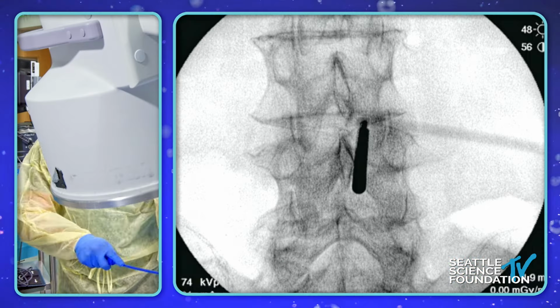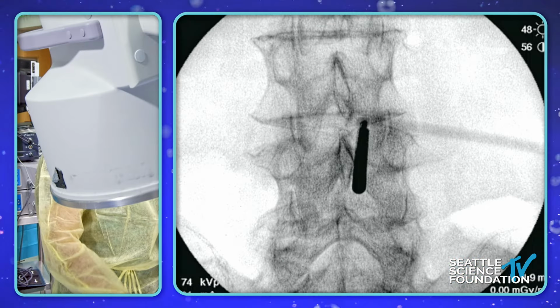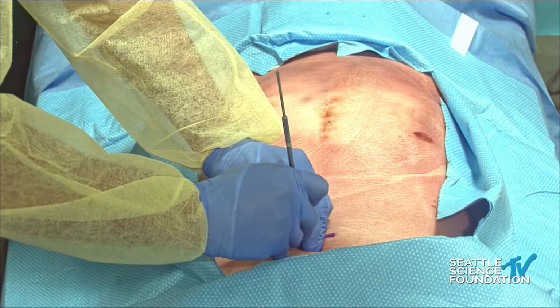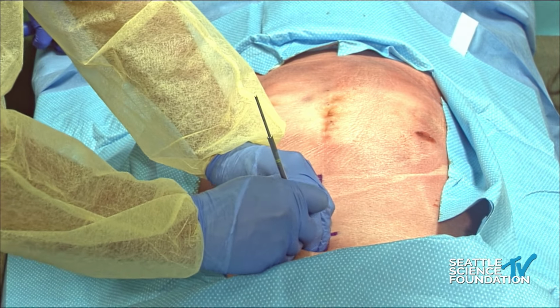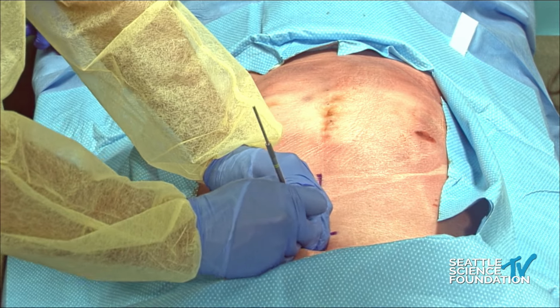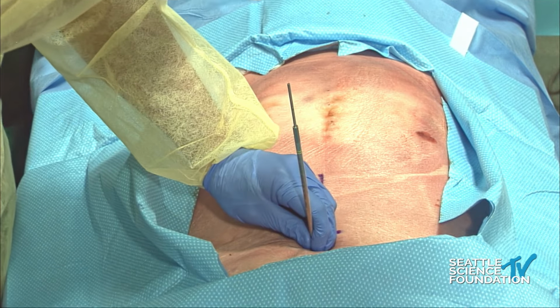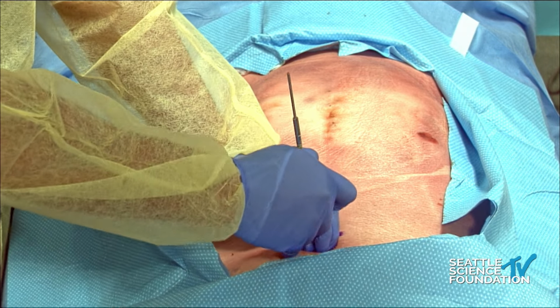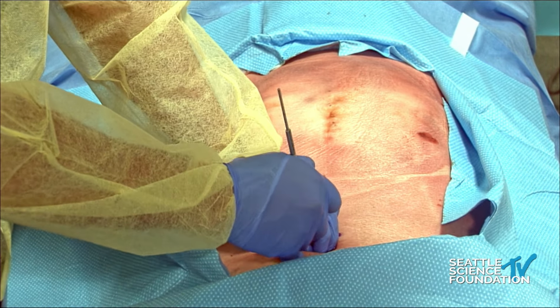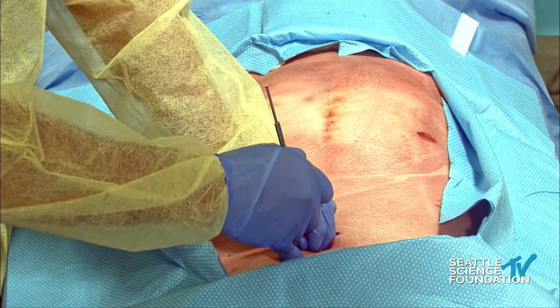So I went from that inframedial edge, and now I'm palpating. I'm feeling my, if you see my hands, they're falling off that lip of lamina here. And then while I'm doing that, I'm also doing some blunt dissection. So you can see as I put the next size up here, again, I'm feeling the dip off, the fall off the lamina there.